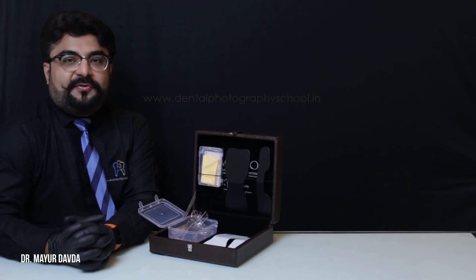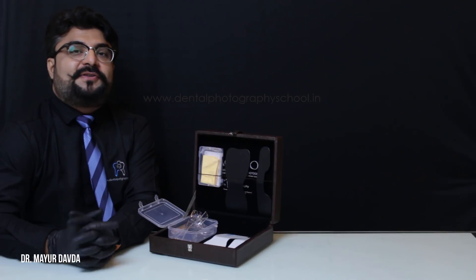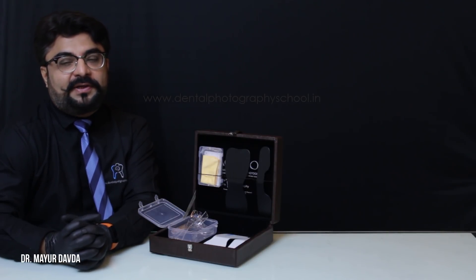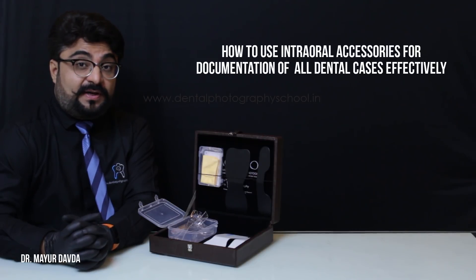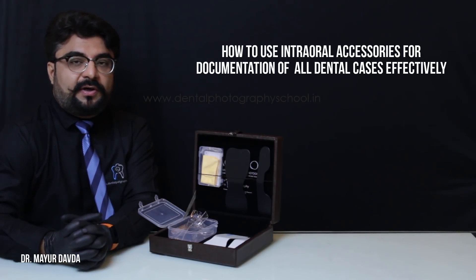It really does not matter if you use a DSLR or if you use your phone for documentation, if you don't know how to use your intraoral accessories correctly for documentation purposes. That is why I am making this video on how to use intraoral accessories for dental documentation.